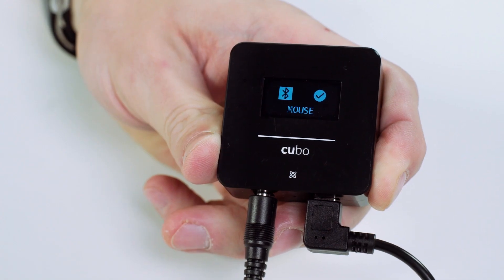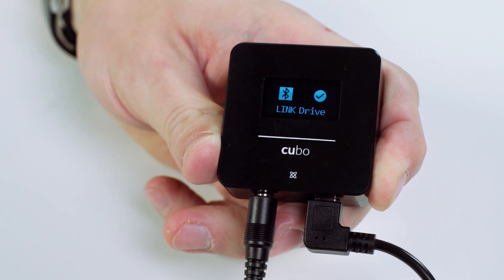To switch back to driving, simply long press the sensor or auxiliary switch again until the Cubo screen illuminates and displays 'link drive.' Don't forget the VEGO will be deactivated when you switch back — you will have to tap the headrest sensor again to continue driving.